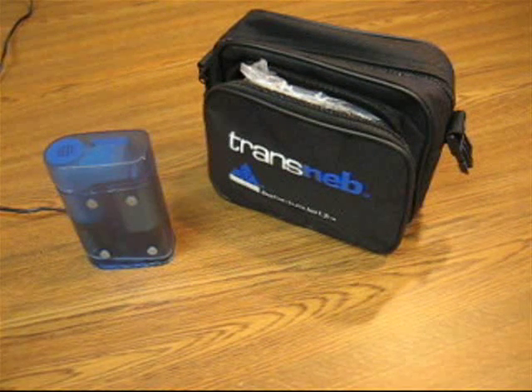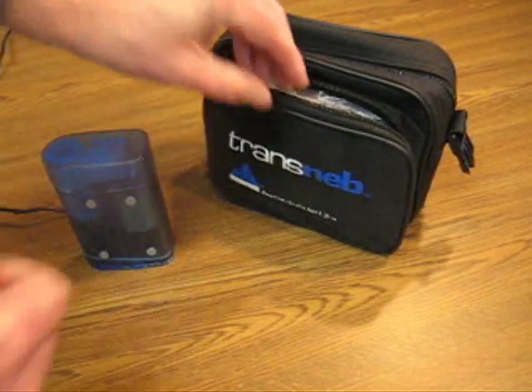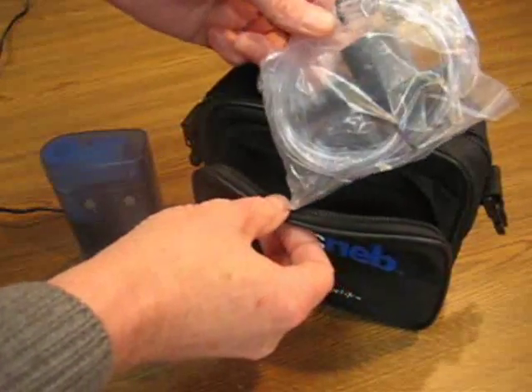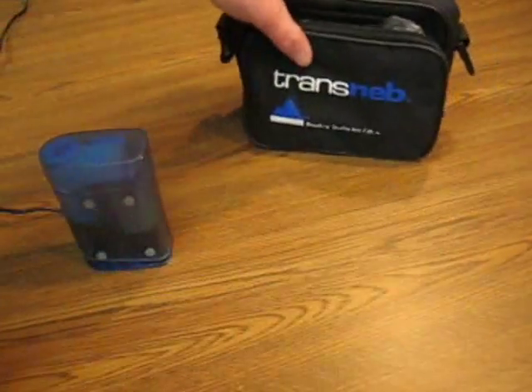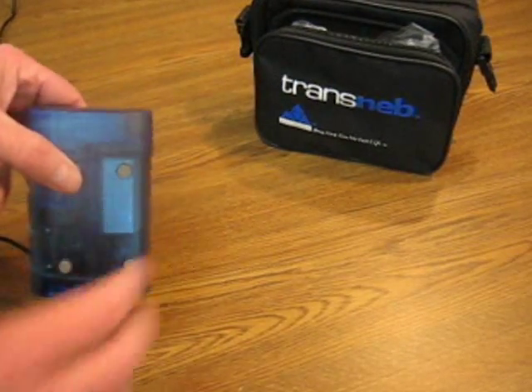In this video we're going to talk about how to use the extension tubing that is supplied with your Transneb package. Most people will receive a package with a pouch like this that has a tubing kit inside, and we're going to explain to you what that tubing kit is actually for.